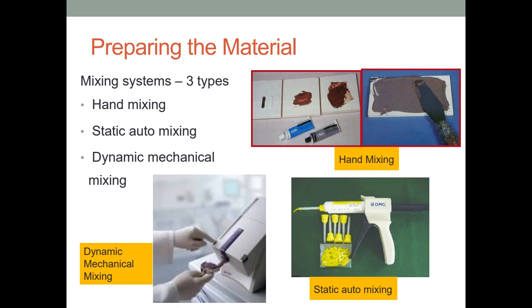The other technique which we are using in our clinic is the static auto mixing technique. You can see such guns in your clinical sessions, by which we are mixing and dispensing the material. And the third is a dynamic mechanical mixing machine, which is an auto mixing machine. In such machines, mainly polyether materials are mixed.